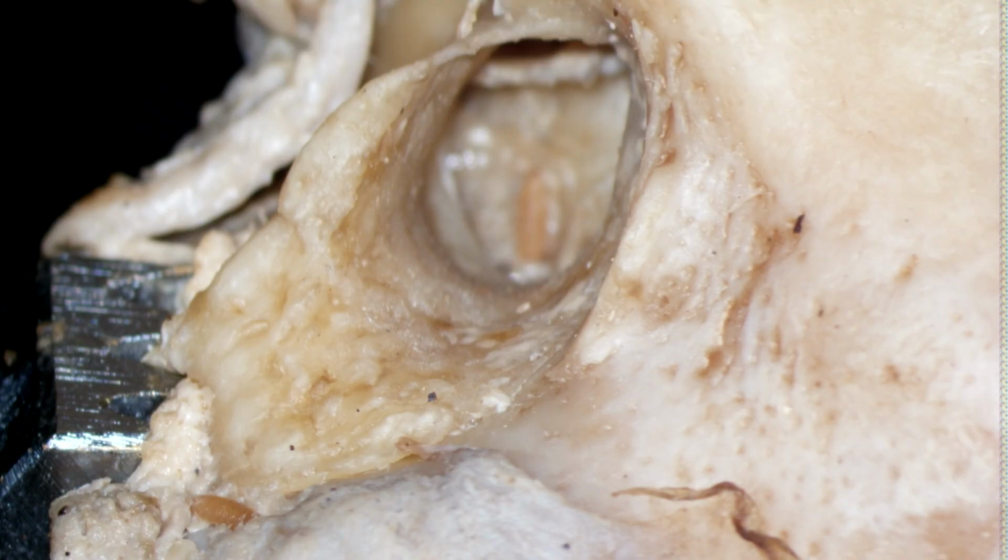What is the plan? The plan is to start with cortical mastoidectomy, and then we'll do a posterior tympanotomy, followed by a canal wall down mastoidectomy, followed by labyrinthectomy, facial nerve decompression, and then labyrinthectomy to reach the internal acoustic meatus, right? So that is the plan, and I am hopeful that you all know about the cortical mastoidectomy. So what are the landmarks for cortical mastoidectomy? Let's start with.